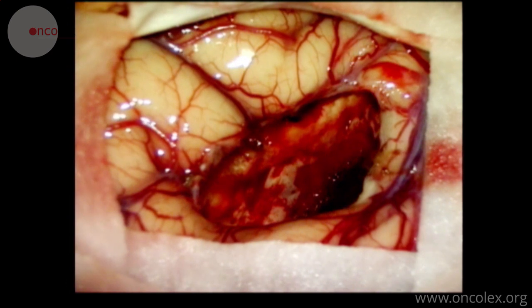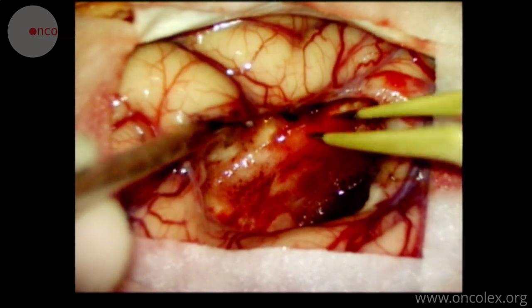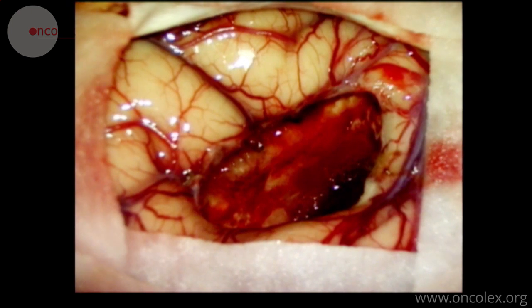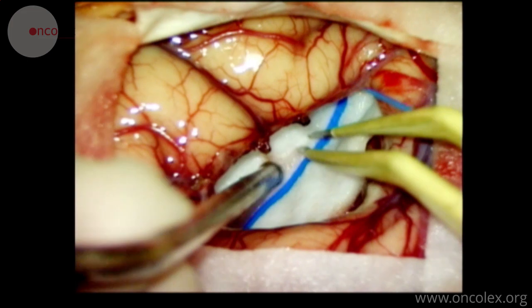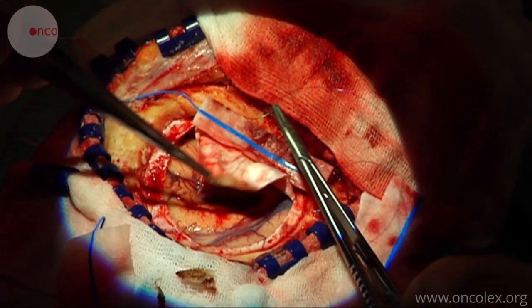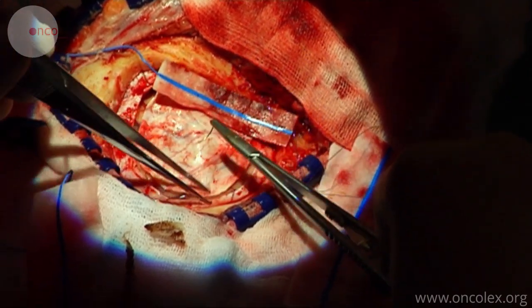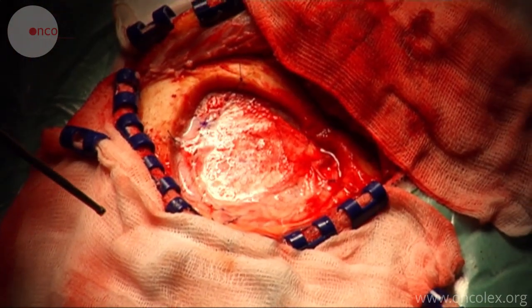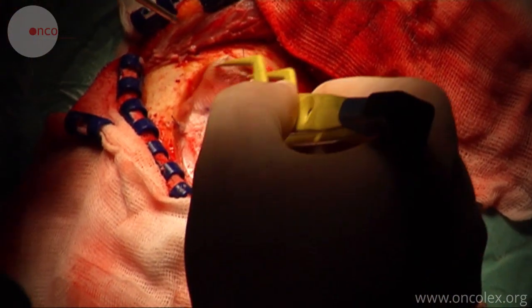We flush the cavity where the tumor was situated and insert self-absorbing coagulation sponges. The dura is sutured back in place and attached to the holes in the bone edge. More sponges are applied, and a suture is placed in the middle of the dura flap.